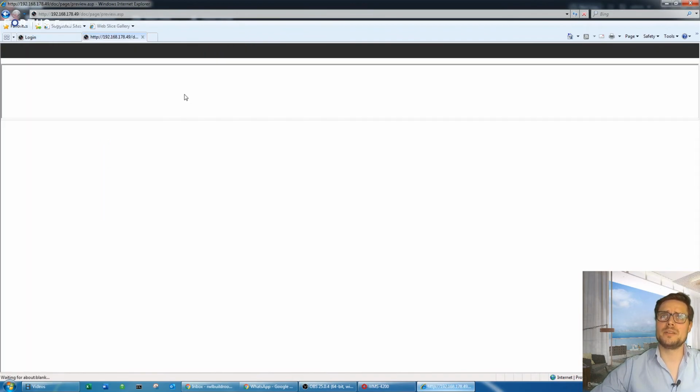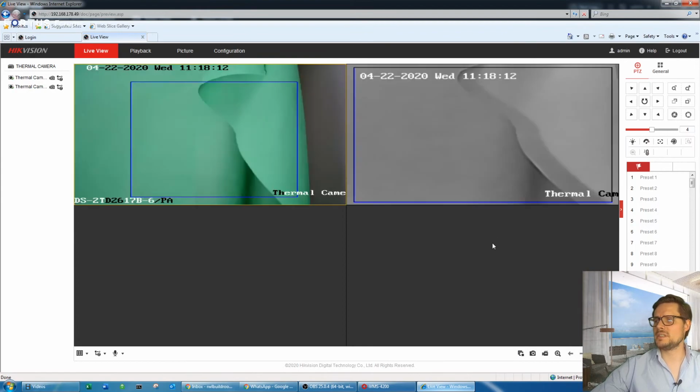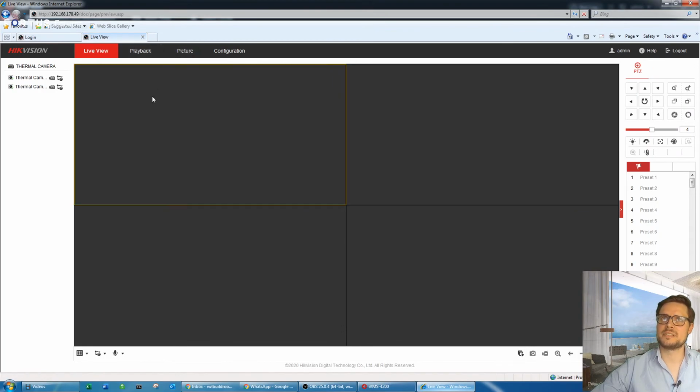Once you have that done, we're just going to go to the live picture, and like you see, there are 2 cameras listed on the left hand side. If I go play, that's it, that's our camera. I'm just going to stop it here for a second.